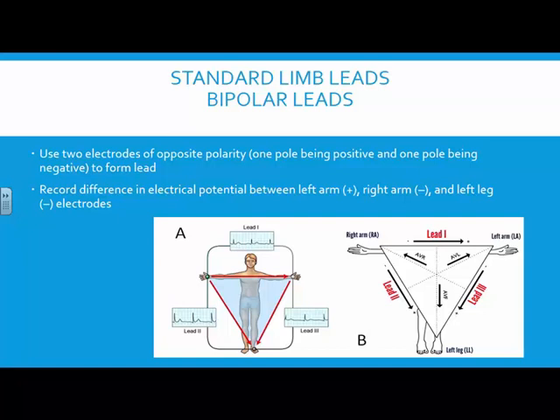Now, y'all are used to the monitors. Well, I think the hospital, they just have 3 leads. No, the hospital has 5 leads. Well, they use the 3 leads for codes. But the rest of the time they use 5 leads for regular lead 2 monitoring. But anyways, you're used to the green lead as well. All right, so this is a ground that provides a ground.